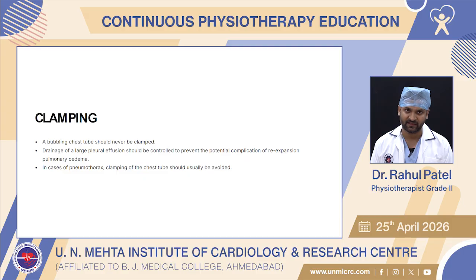Clamping. A bubbling chest tube should never be clamped. Drainage of a large pleural effusion should be controlled to prevent the potential complication of re-expansion pulmonary edema. In cases of pneumothorax, clamping of the chest tube should usually be avoided.